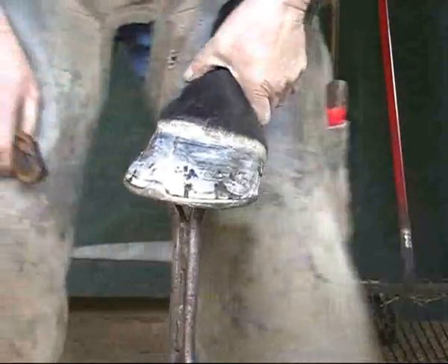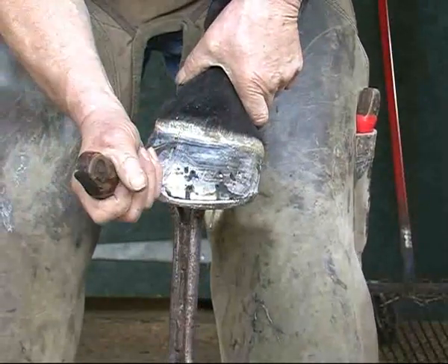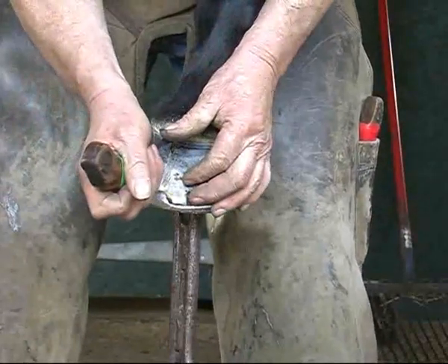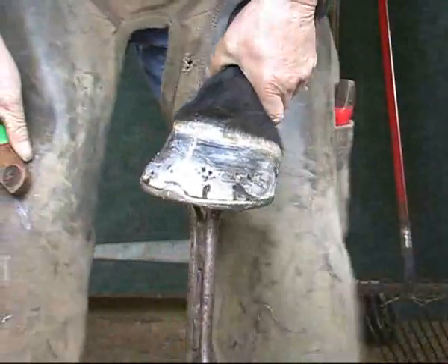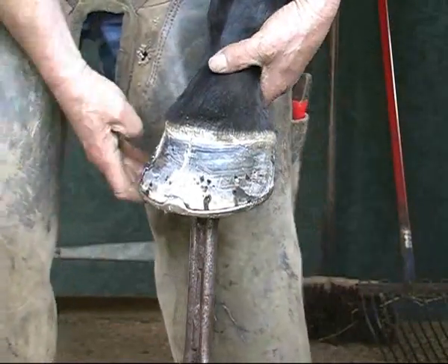I've now disinfected the area with isopropanol alcohol, undercut the edges of this, and burned into the edge of the crack that we're going to cover up. We'll just wait for it to dry, tidy this little bit up here. I'll put in a base level repair onto this, wrap it in cling film and let it dry off, and then we'll put a top coat — a fibreglass strap — over it.